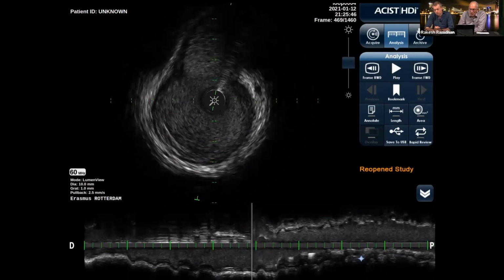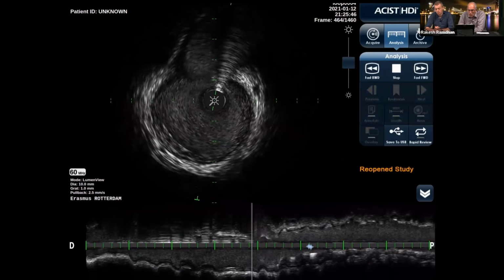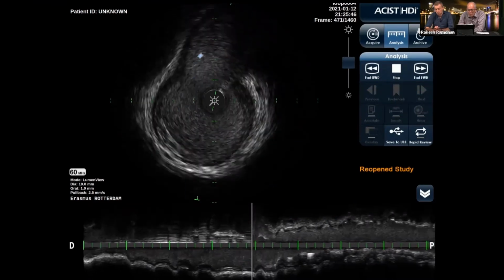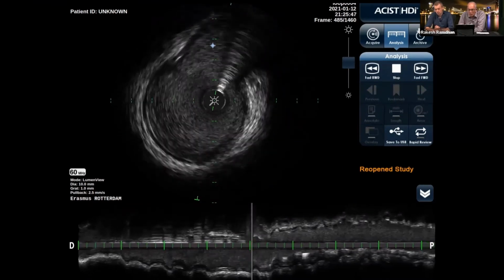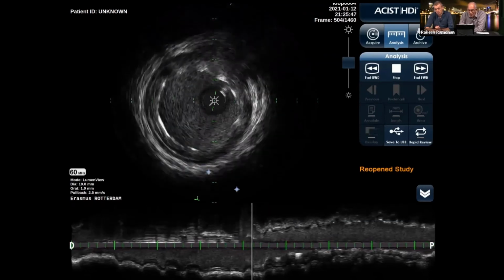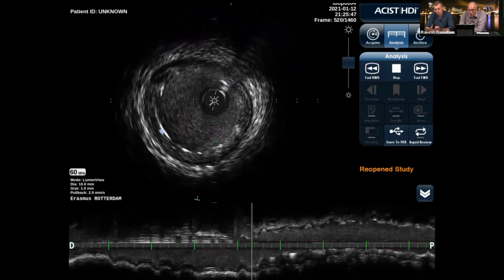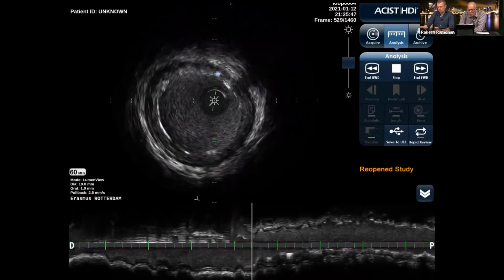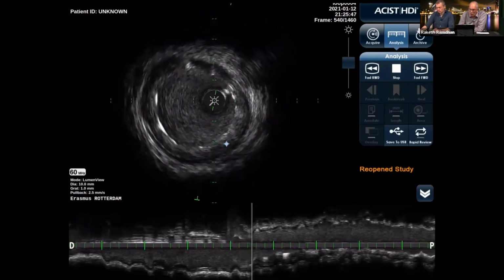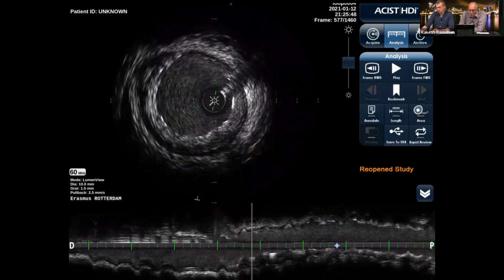Absolutely. Yeah. Well, this is after the stent. Let's see if the stent size was according to the measurements. I think the choice was good. So we start moving. There is this side branch, and the operator places the stent. Yeah, you see it's just halfway over the side branch. Here's a stent. You can recognize them by the small dots around. And what you can also appreciate is that the stent struts here are against the lumen wall. So we have a good apposition and a good lumen.